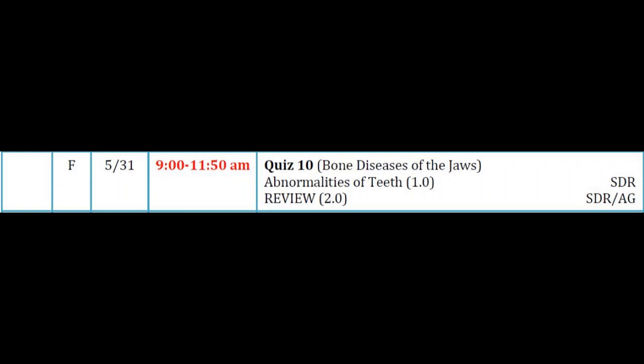All right. Vital tooth, no bone expansion, incidental widening, asymptomatic lesion. What is the best diagnosis for this lesion? Idiopathic osteosclerosis. Yeah. Nice. Really well-defined dense opacity at the apex that fuses with the lamina dura, but you can still see the regions of the PDL, so it's got to be idiopathic osteosclerosis. And what about the crown of the tooth? No decay, no restorations. I thought, isn't that a restoration right there?